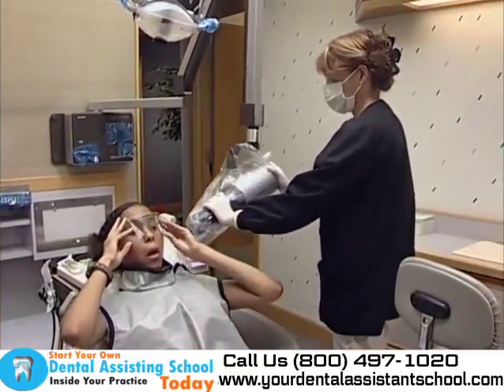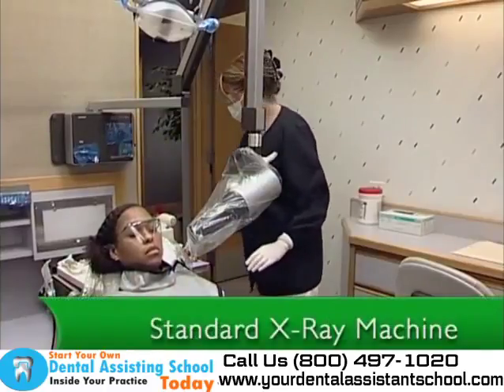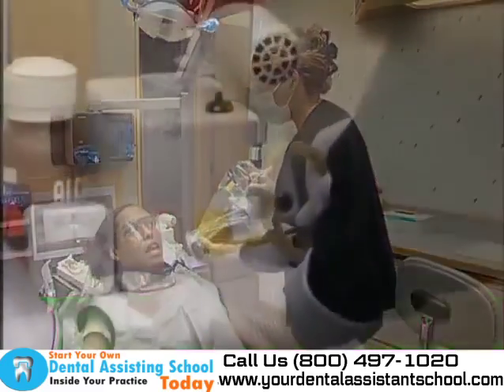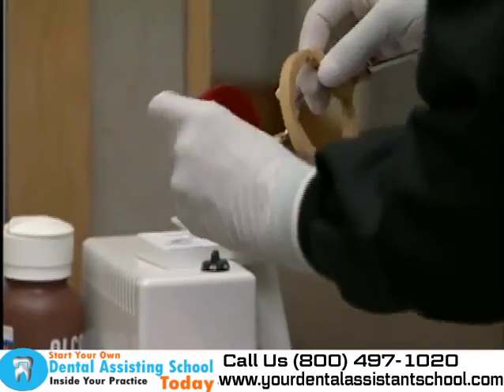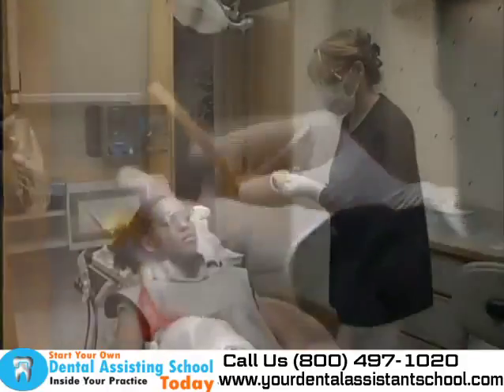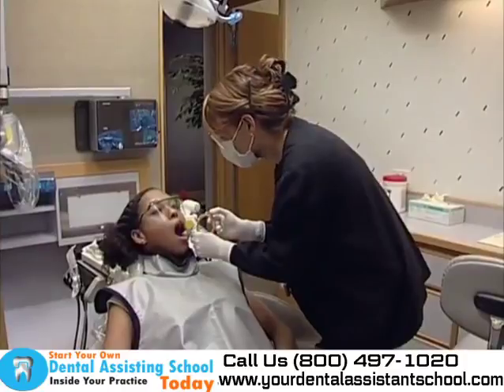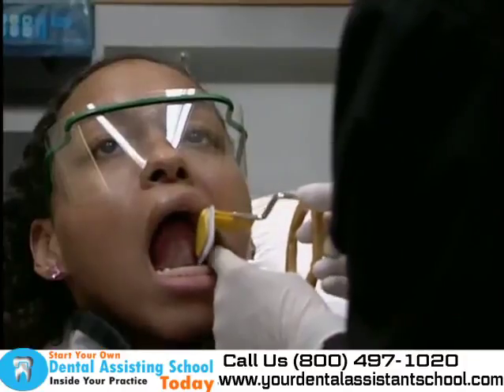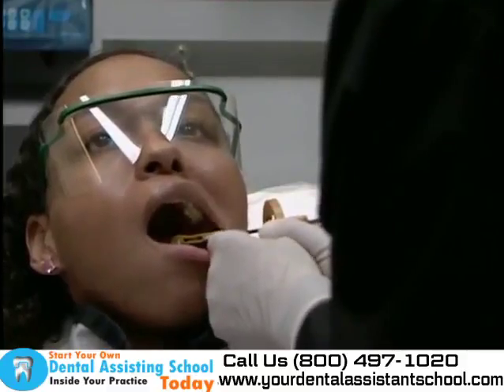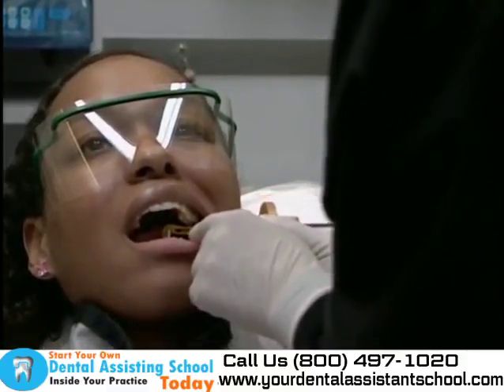There are many different types of X-ray machines available today. Standard X-ray machines are used for taking bite wing and periapical X-rays. When using a standard X-ray machine, the film is placed into a film holder, and the film and film holder are placed in the patient's mouth. There are several different types of holders, depending on the type of X-ray to be taken, the operator's preference, or the size of the patient's mouth.